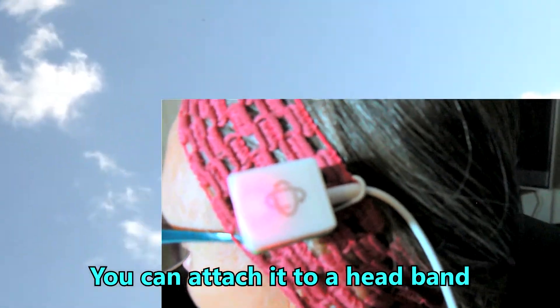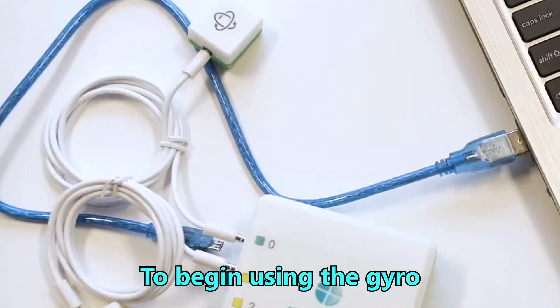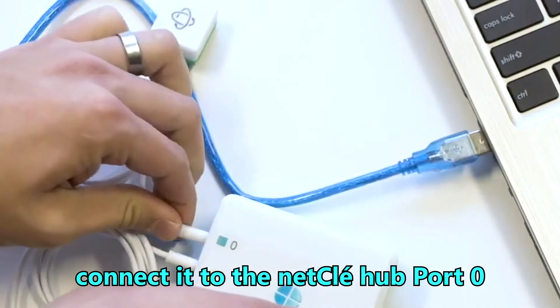You can attach it to a headband, hat, or even clip it onto your glasses. To begin using the gyro, connect it to the netClé hub Port 0.